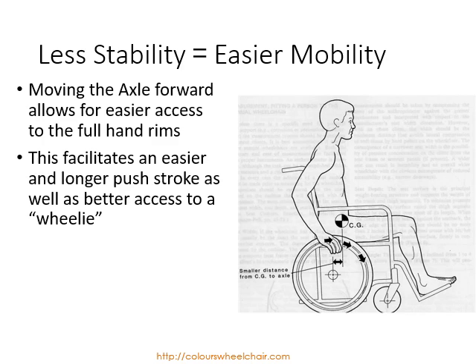On the other hand, if we move that rear wheel forward, it's going to decrease the base of support of the wheelchair, and it's going to make that wheelchair less stable and help the patient get into a wheelie position if they want to pop a wheelie. It also makes the strokes a little bit easier and longer.